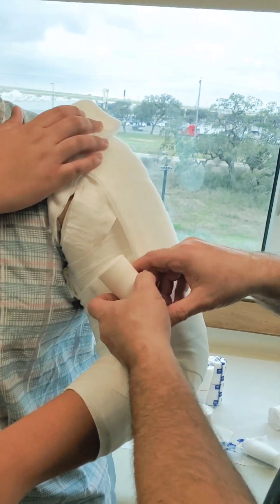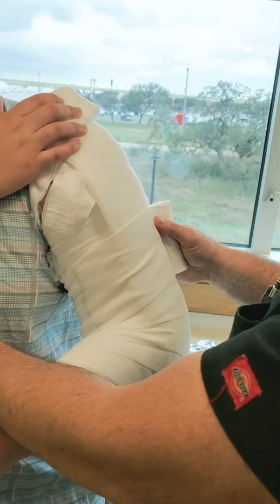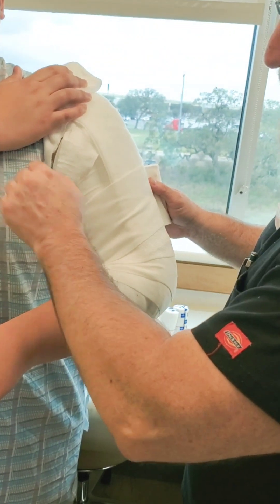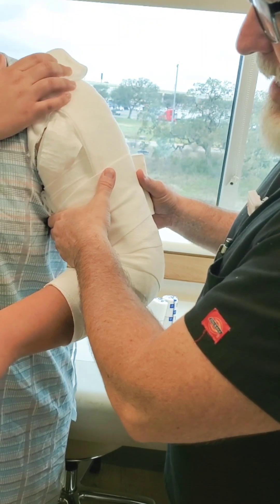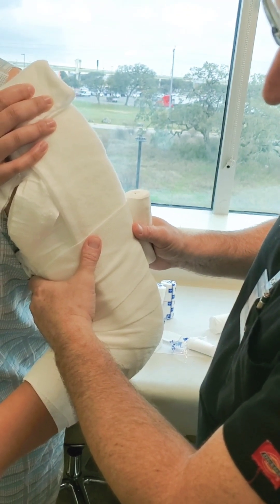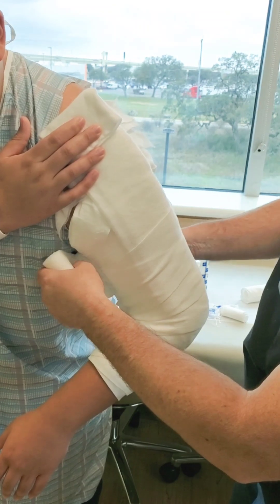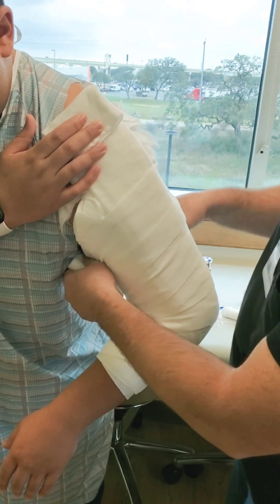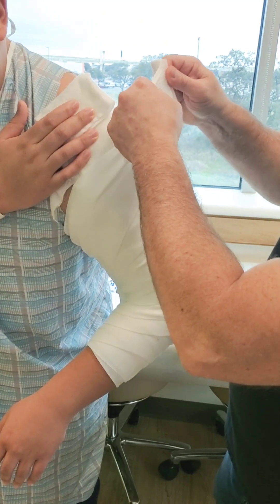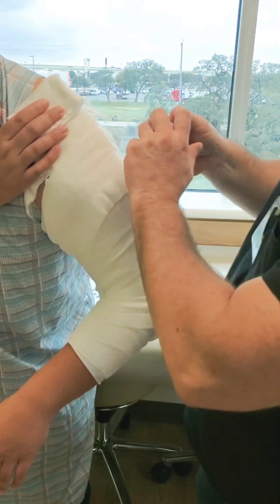In a real patient scenario, every time you come into the axillary space they would be in pain because their arm is broken. Here's a trick: stand the patient up, hold their arm in place, and have them lean forward at the waist — dead weight, let the arm hang. As they lean down, their arm breaks away from their torso and you can get in there without moving them too much. That same twist trick from the cotton can also be done with the ace wrap if needed.